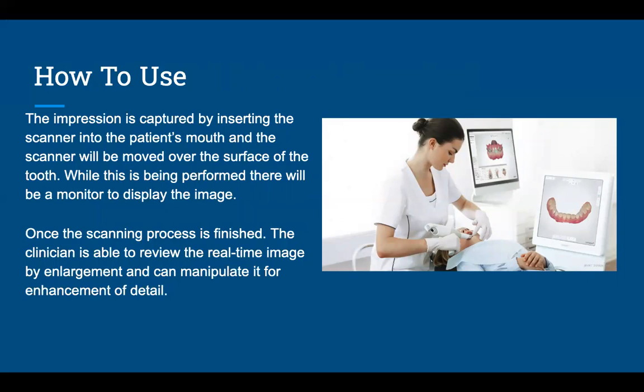What's really cool about this is that you can enlarge the image or manipulate it, and it's really nice for dentists, especially if they want to enhance detail, and they can use it during restorative work if they want to see something very specific that they're trying to work on.